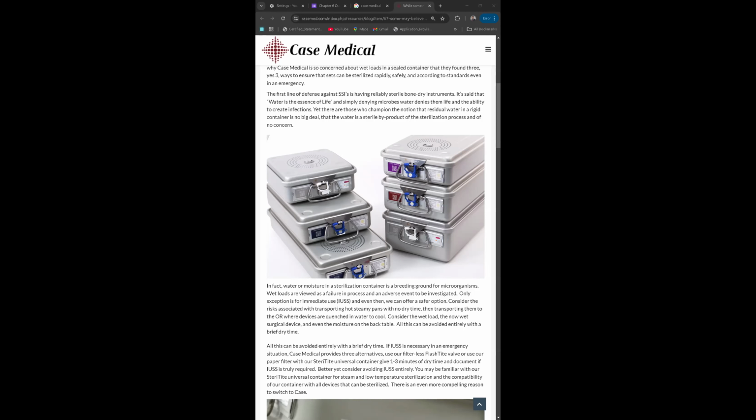If you lift the container and the locks are in place, the filters are in place. You see that the locks are blue, some are white, you could get some orange, depending on the type of sterilization that we are doing. We have low temperature and high temperature. We'll get to that. But for the purpose of this conversation, the basket that we have been talking about goes inside this. Filters are put in place to reduce direct contact of microbes with the instrumentation, and to further prove that nothing has touched the instrument, we put a lock there.